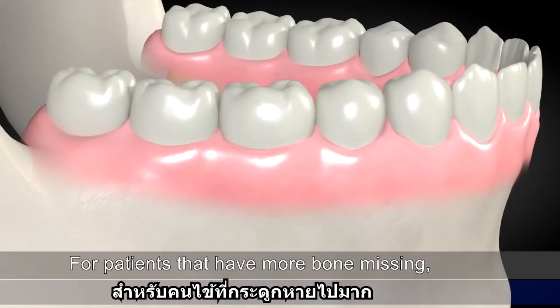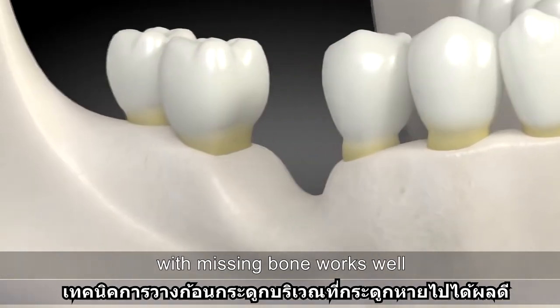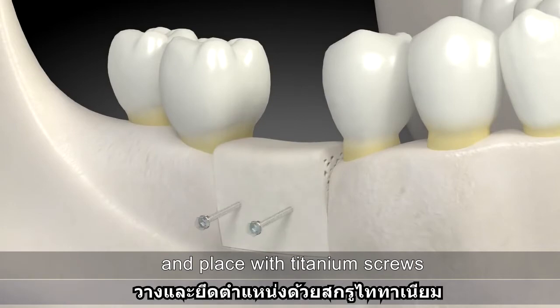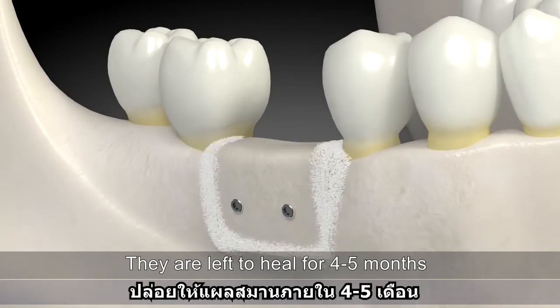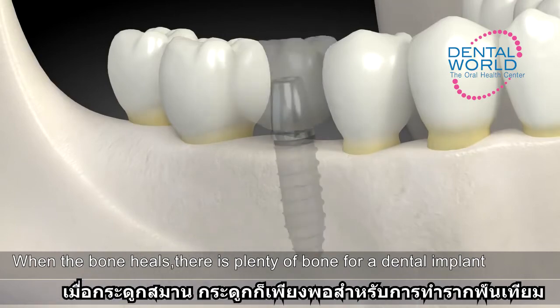For patients that have more bone missing, a technique involving placing blocks of bone in the area with missing bone works well. The blocks are shaped to the desired size and placed with titanium screws. They are left to heal for four to five months. When the bone heals, there is plenty of bone for a dental implant.